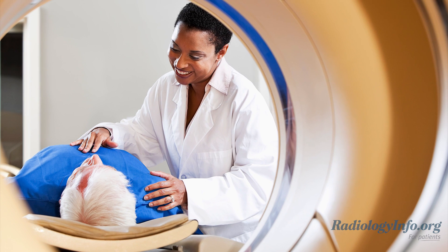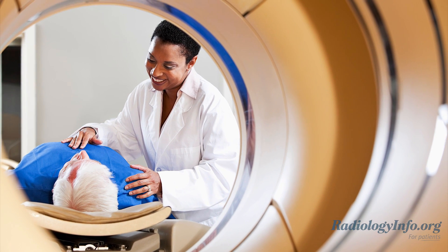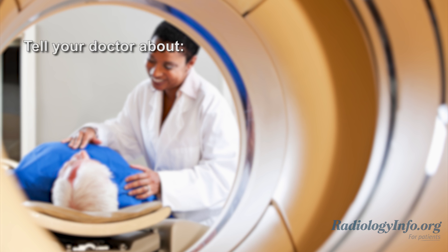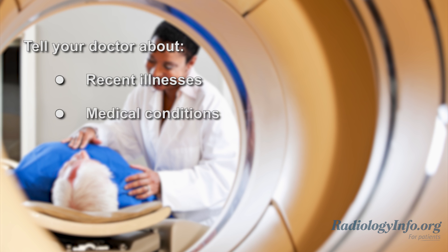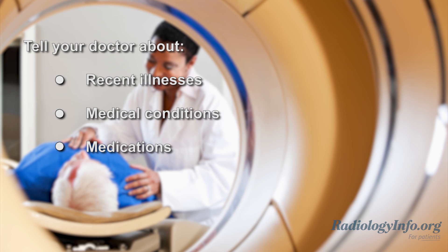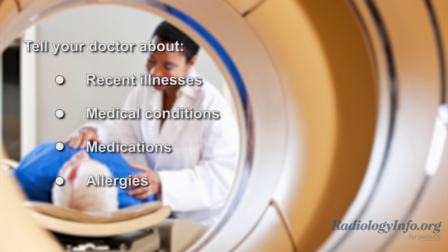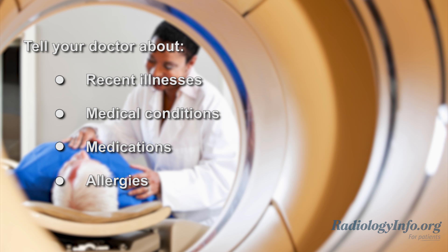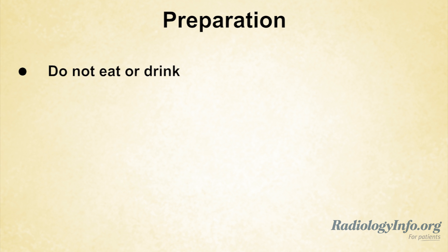If you're scheduled for a CT scan, there are several important things you can do to prepare for the examination. First of all, tell your doctor about any recent illnesses, medical conditions, or medications you're taking, and whether or not you have any allergies. If you have a known allergy to contrast material, your doctor may prescribe medication to reduce the risk of an allergic reaction. On the day of your exam, you may be asked not to eat or drink anything for a few hours beforehand.